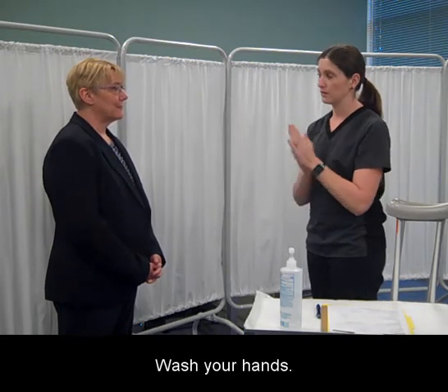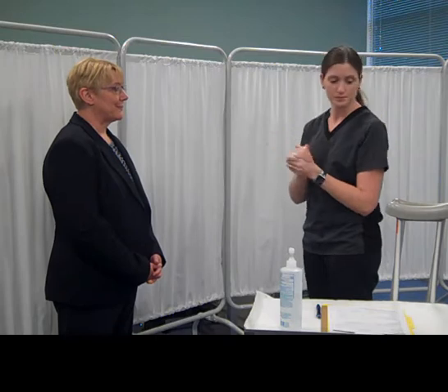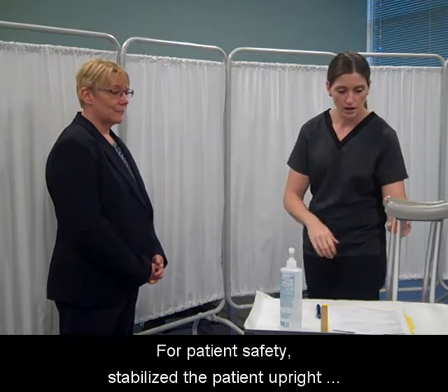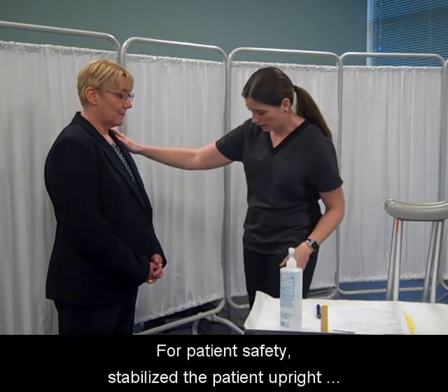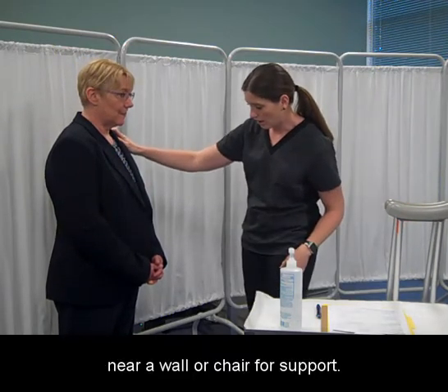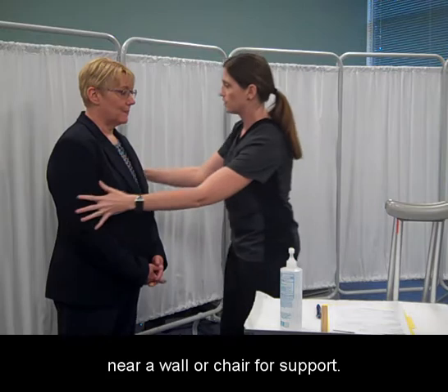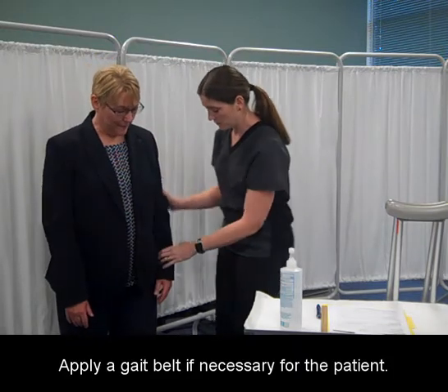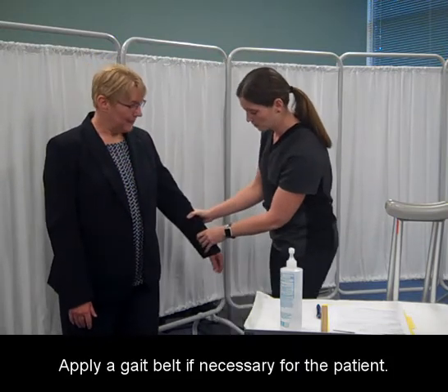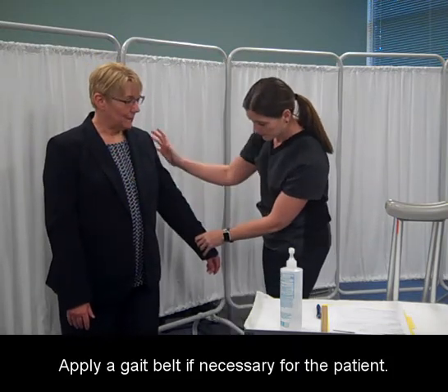Wash your hands. For patient safety, stabilize the patient upright near a wall or chair for support. Apply a gait belt if necessary for the patient.